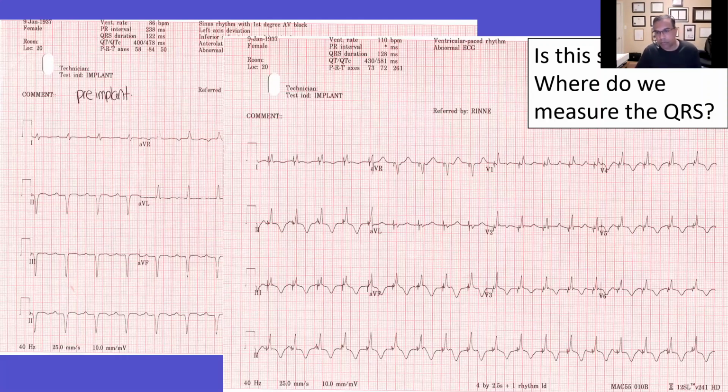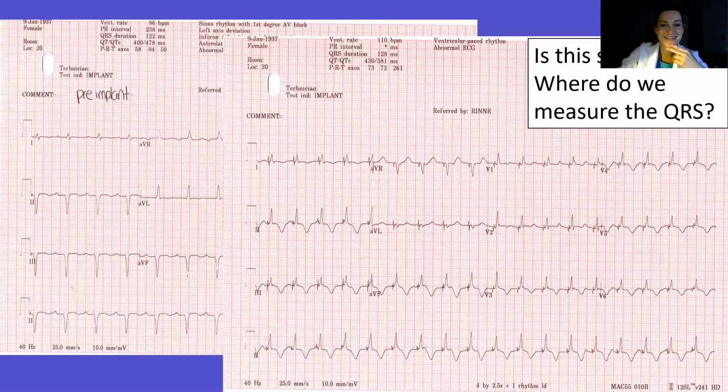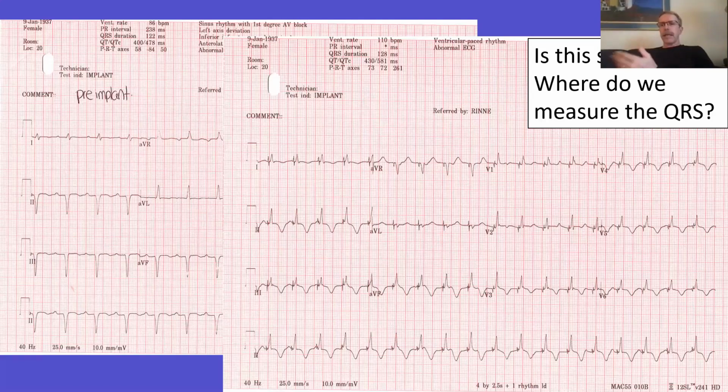And, you know, to my eye, that's kind of what it looks like. So for the purposes of a study or a trial, I would have people measure the latency and measure the QRS duration. Measure latency? I guess that depends on which lead, because in some leads there is really no latency. You can always find leads that look like there are, but if you look at all 12, there's some that have it.